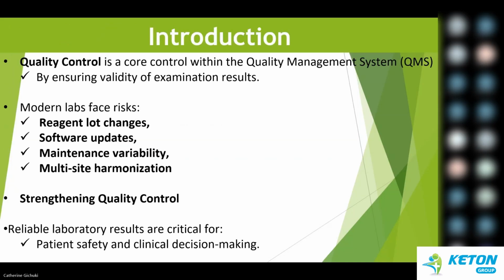So what is quality control? I'm not giving the technical definition, but I'm saying it's a core check within our quality management systems. And this usually ensures the validity of the results that we are producing after the examinations.